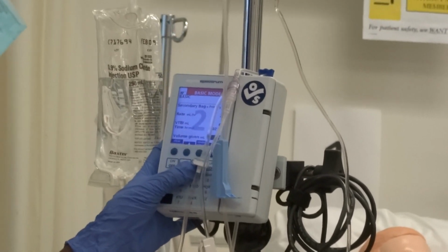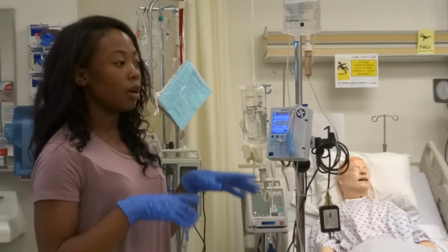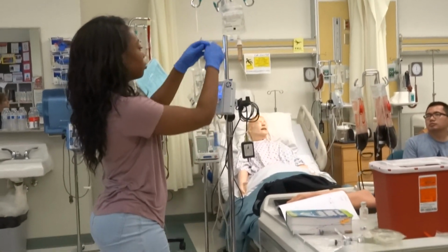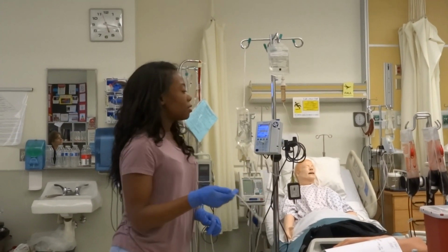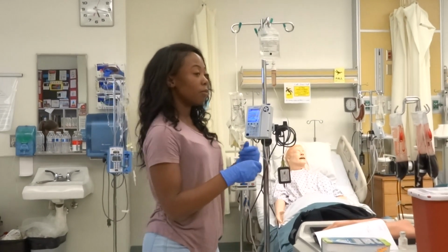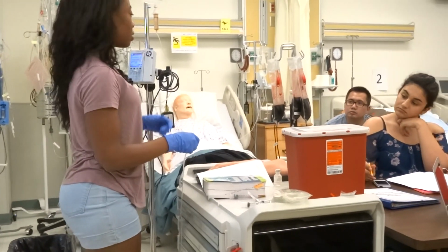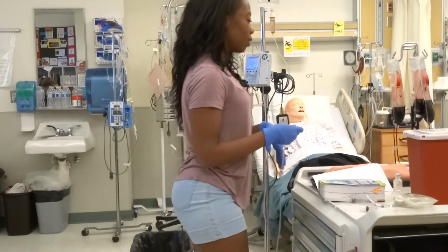Okay. All right. So everything is ready to go at this point. You just have to connect this IV back to the patient, or if it's already on there, then that's fine. But stop at this screen, because once you attach it, you're going to clean the port and attach it to your patient. You don't want to have already started running the medication while you're attaching it to the patient. You want to make sure it's already connected, then try to run it, make sure your drips are falling, and then go. Okay, so do it in that order.